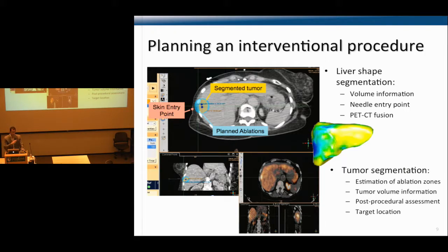So I'm not going to go through all of the detail in terms of the planning. There's a lot of research going on to optimize the planning procedure, to find the best spot to insert the needle and how to go about reaching the target.